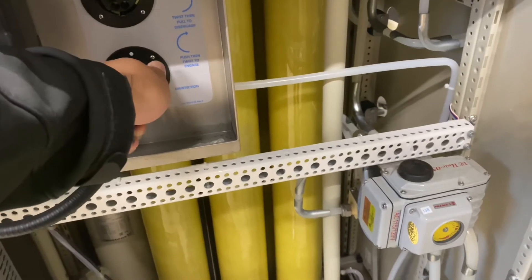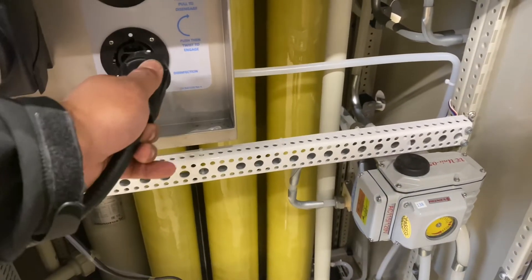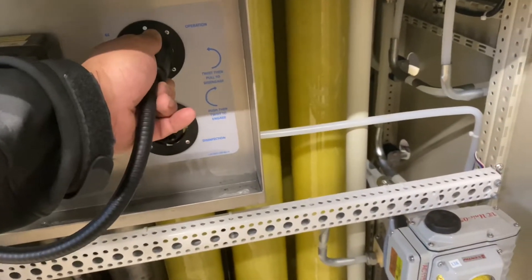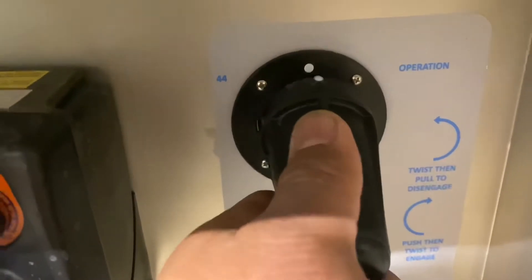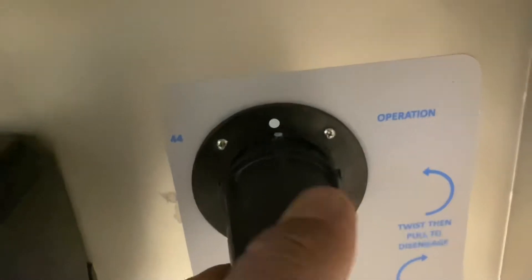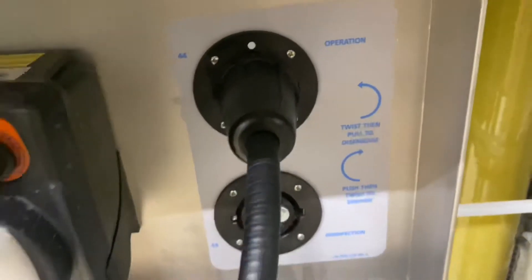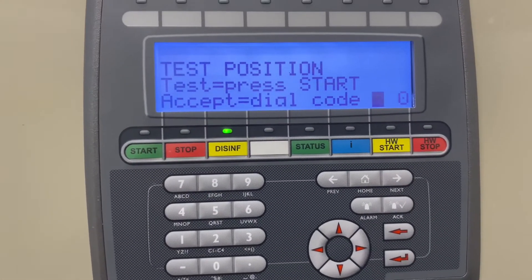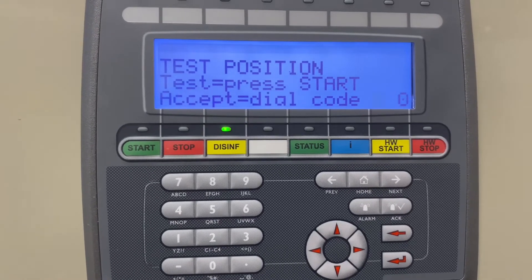Push and turn left. Put it on the top one — see that white dot in there? That goes in the same spot. Push, then turn right. Now move to the front panel — it says 'test position, test.' Press start.